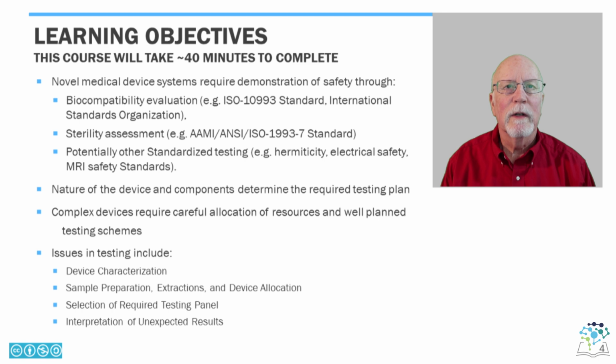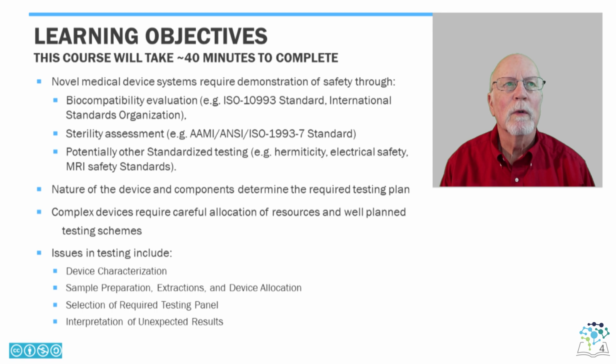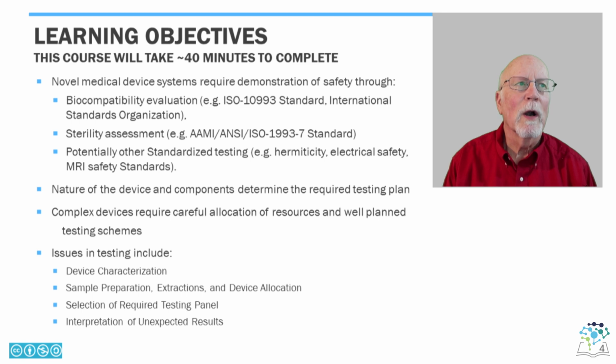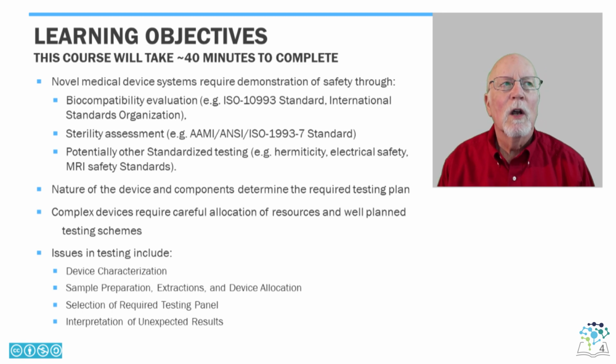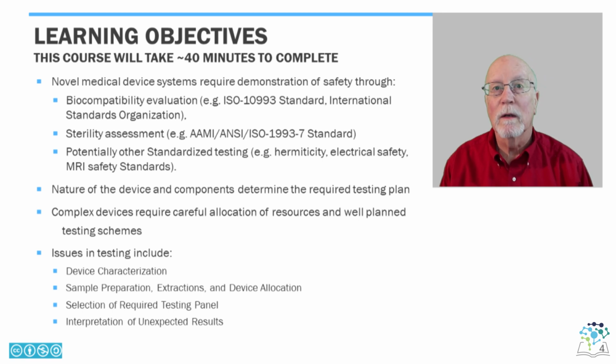Let's review the learning objectives for this session. Novel medical device systems require demonstration of safety through the following: biocompatibility evaluation following the International Standards Organization or ISO 10993 standards, sterility assessment standards, and other standardized testing including hermeticity, electrical safety, and MRI safety, all of which also have their own standards. We'll focus today on the ISO 10993 standards and look at some examples to understand how the characteristics of the device and components determine the required testing plan to meet these standards.